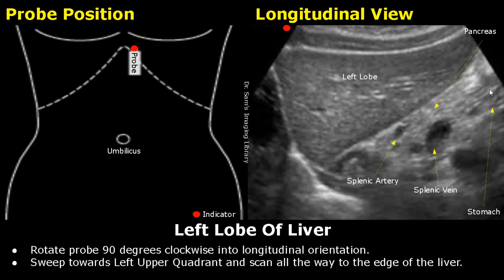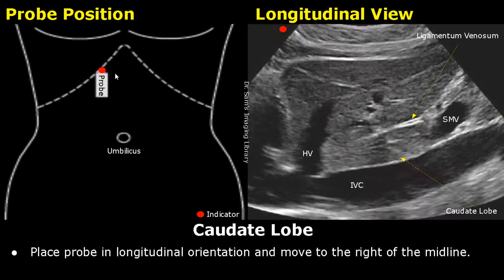The stomach will look like a structure with alternating bright and dark layers. Now move to the right of the midline and you can locate the caudate lobe of the liver. This is the caudate lobe right behind the ligamentum venosum. This large vessel is the inferior vena cava — it is the IVC because it is to the right of the midline. This is the hepatic vein draining into the IVC. This anechoic structure is the superior mesenteric vein.